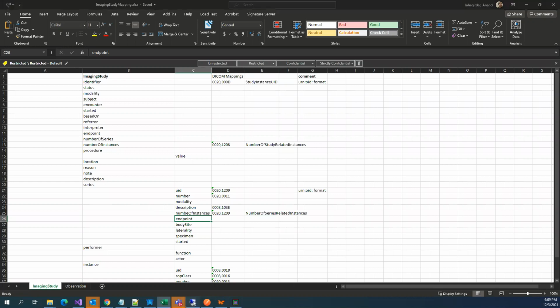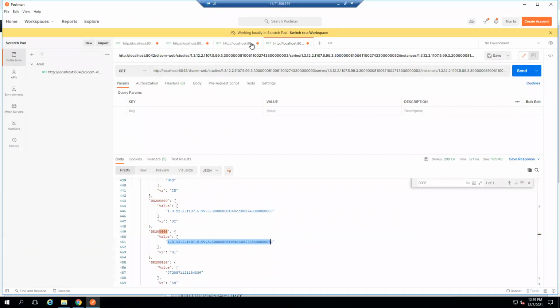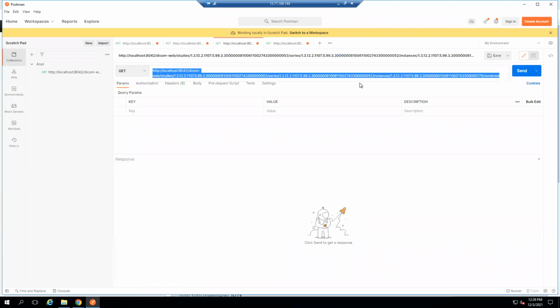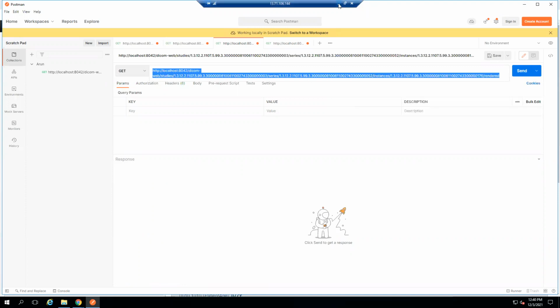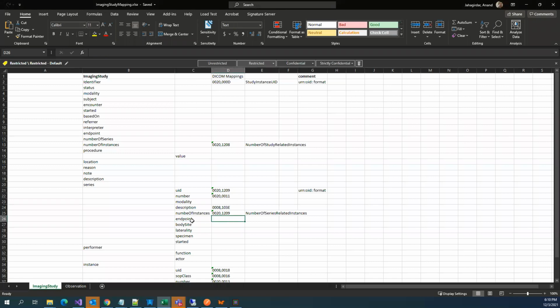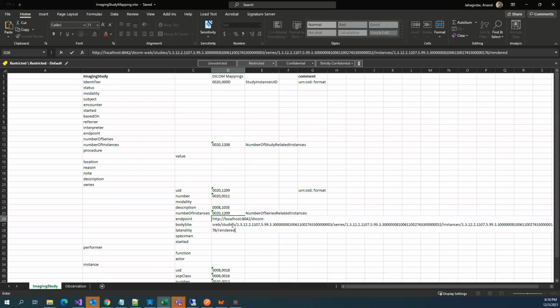So you have this, for example, this is one link. You see, this link is a rendered image. So if you want to get the DICOM image corresponding to that, finally when you are filling that one, you will put an endpoint here. This endpoint also has a standard. You should put, for example, the relative location, all those things. This already has a certain format.